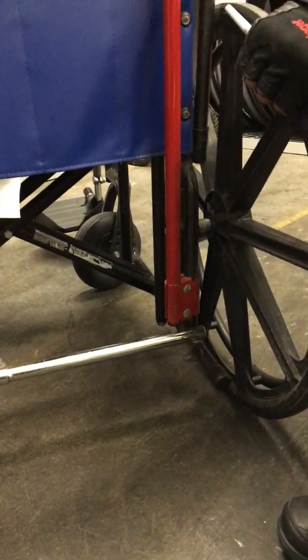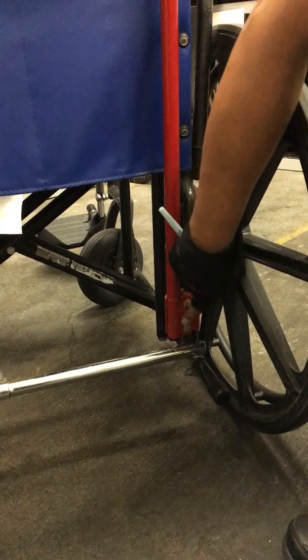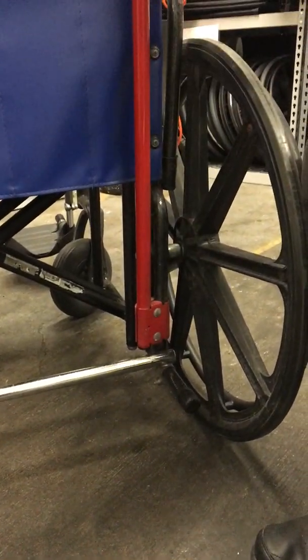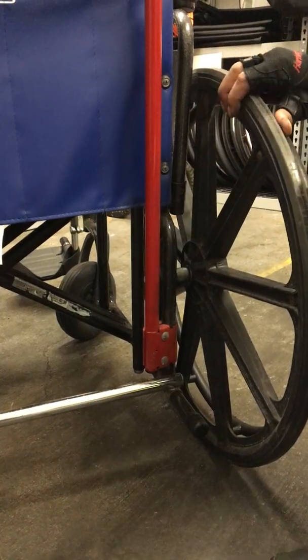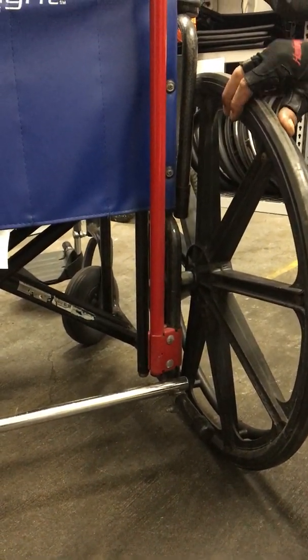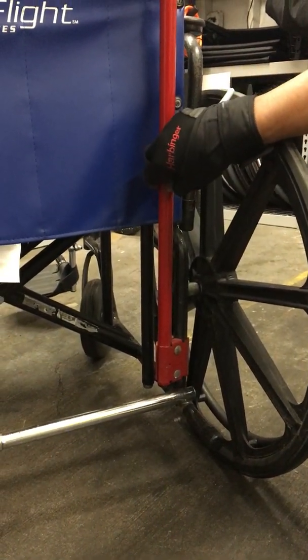Next would be the anti-theft pole. This is fairly easy to change, as long as there is room for the pole. We just got lucky today. So for this design of this frame would take only 10 to 15 minutes. It can take longer because there are times it doesn't even fit this pole.